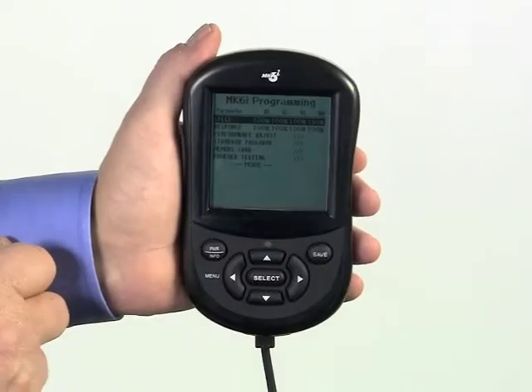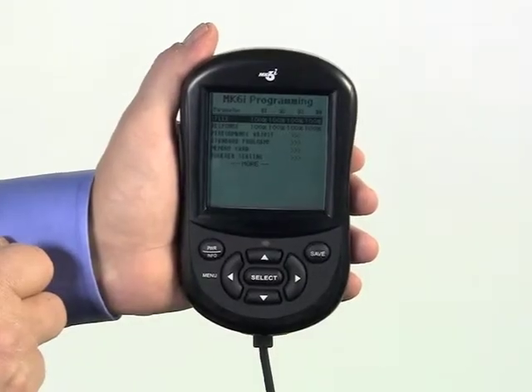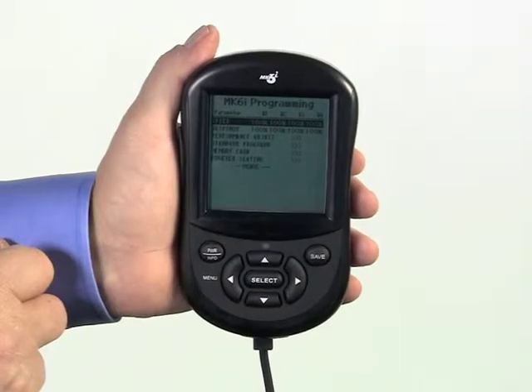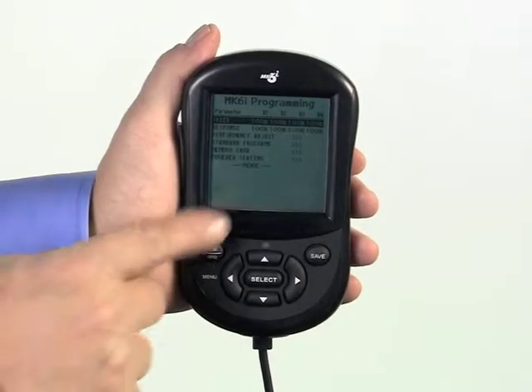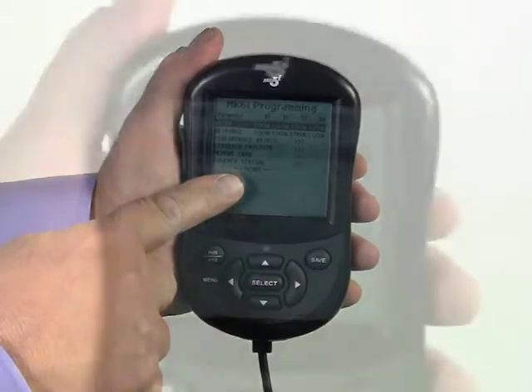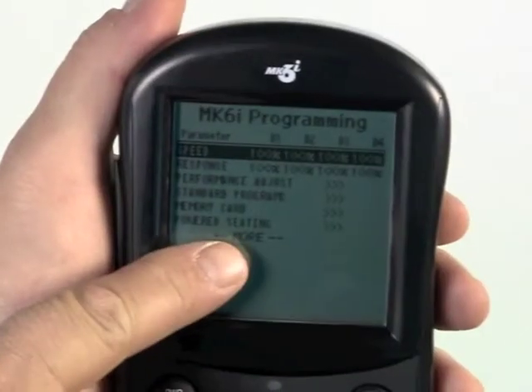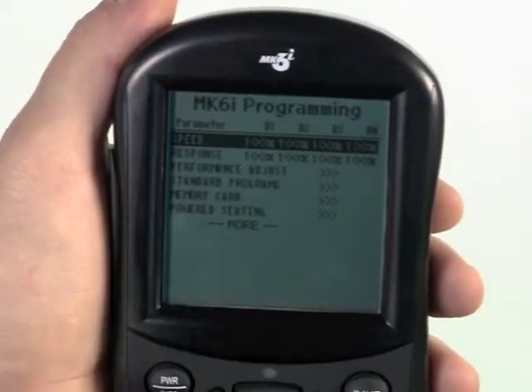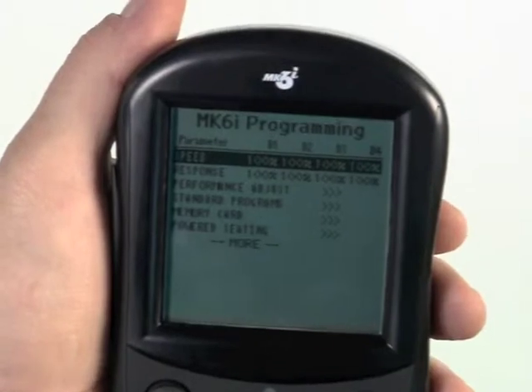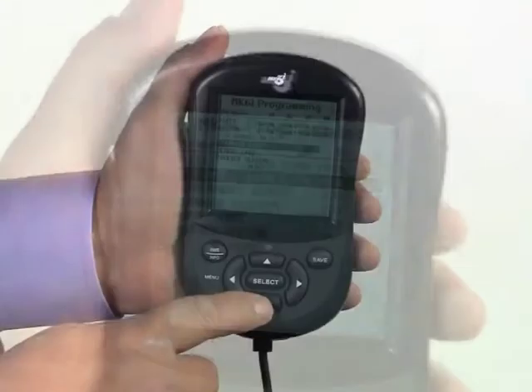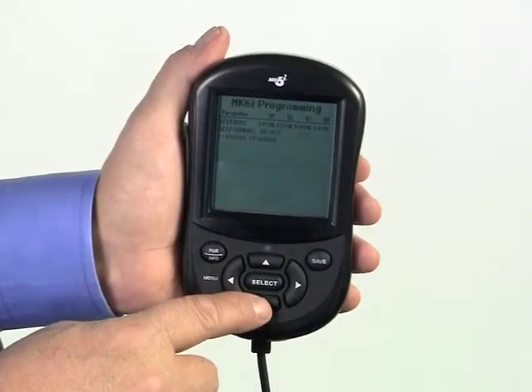The screen of the programmer shows a series of sub-menus. When the word "more" appears, the list continues. The down arrow key will scroll down to see the additional functions.